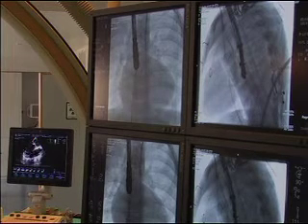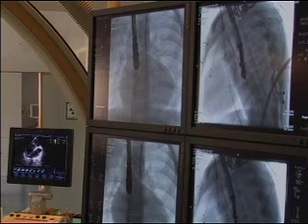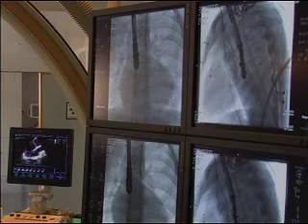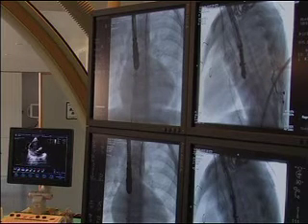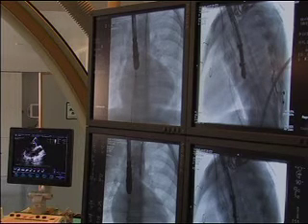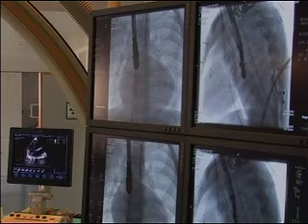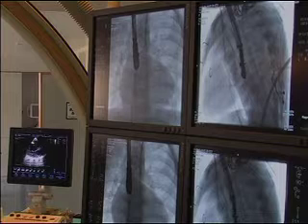I'll try to go there with the. ¿Es eso que hay abajo? Is it a thrombus over there? We have a question from the audience. I think it's very important that you check it in 90 degrees in this angulation, so you have it in two planes where you do the puncture, versus 0 or 180. Yeah. Ahí está muy bien. We will check the coagulation. Podemos mandar una muestra. I don't like this clot there.